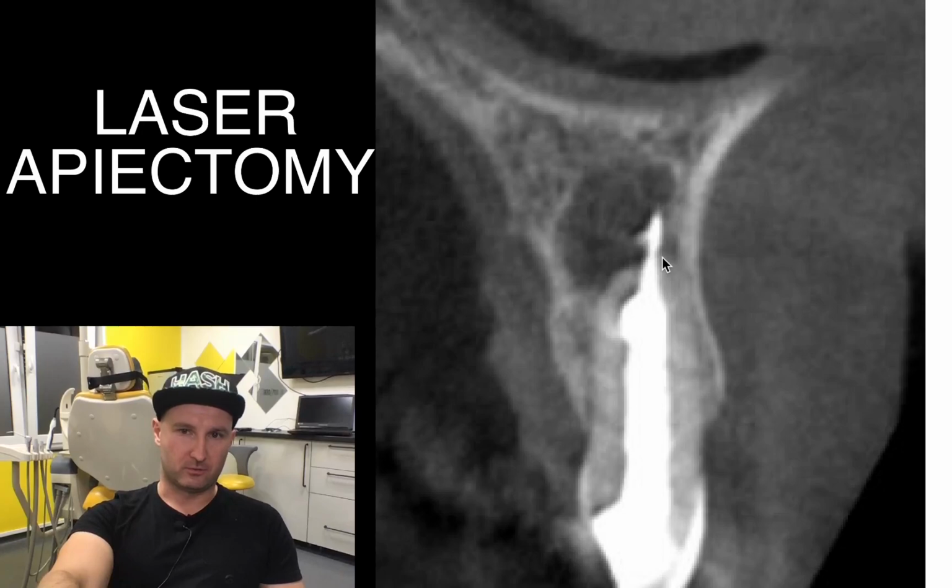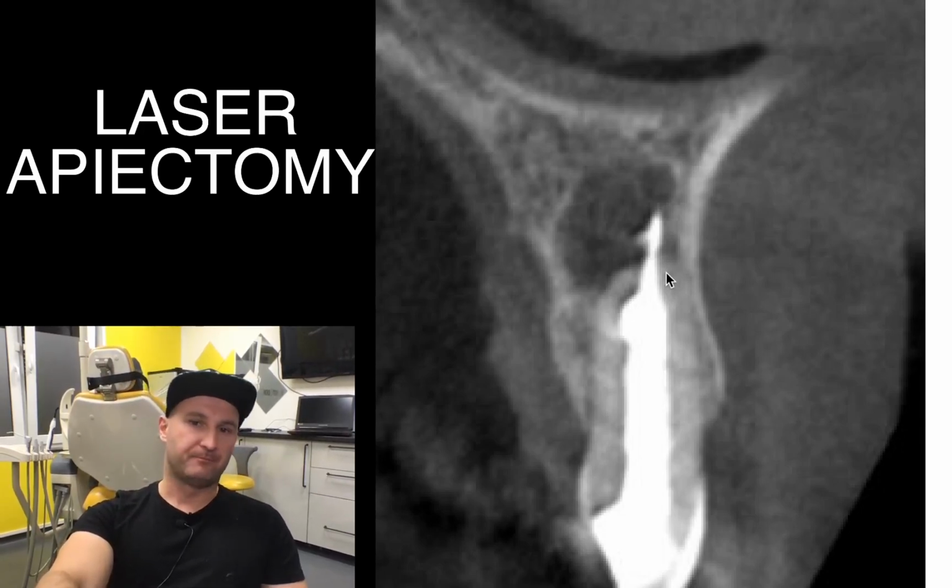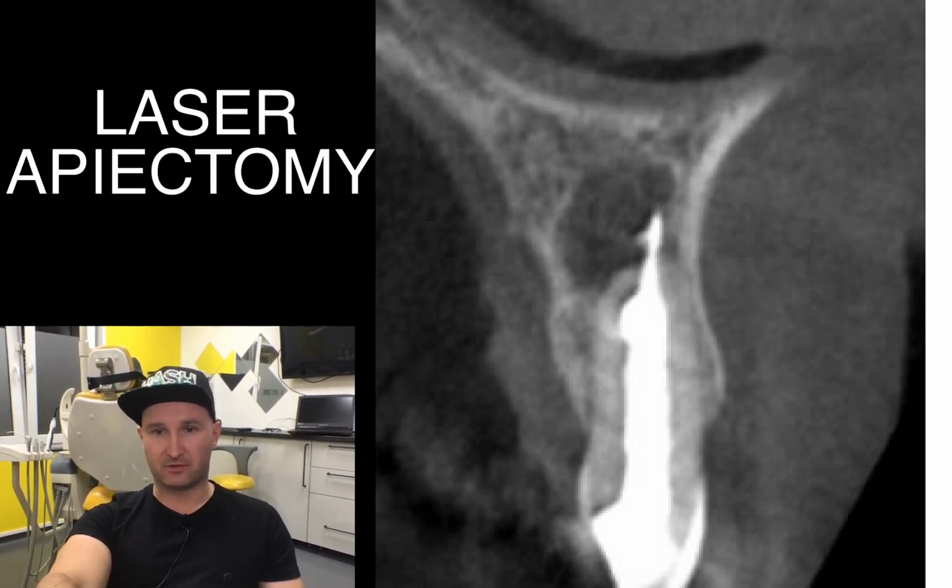We will try to remove the extruded material through the canal if it will be possible. Then we will re-prepare the root canal. After that we will irrigate it with irrigant solutions. Then we will fill the canal, and after that we will close the cavity.